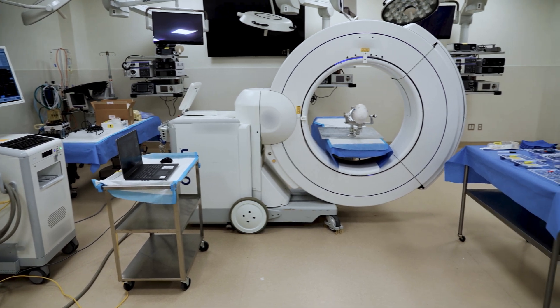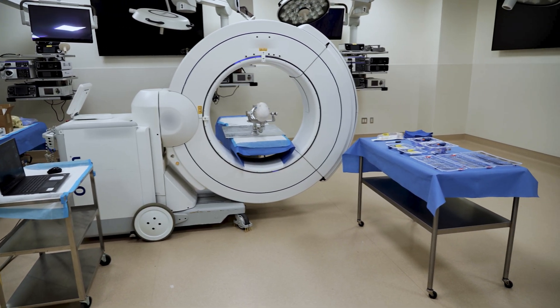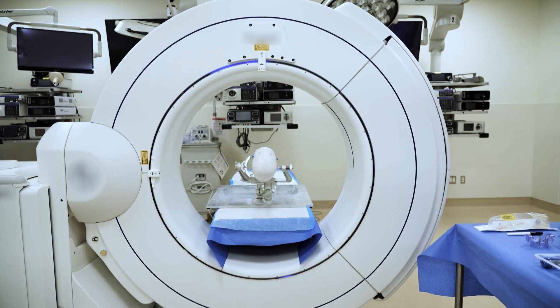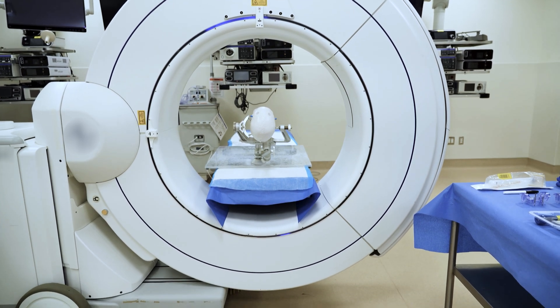The ClearPoint navigation software version 3.0 introduces several new workflows and enhancements, including a new fully ICT guided option. This makes the ClearPoint workflow now available in any operating room using standard ICT scanners.